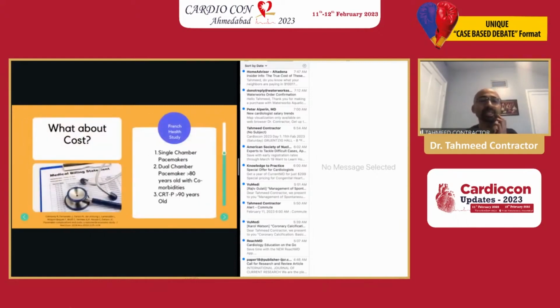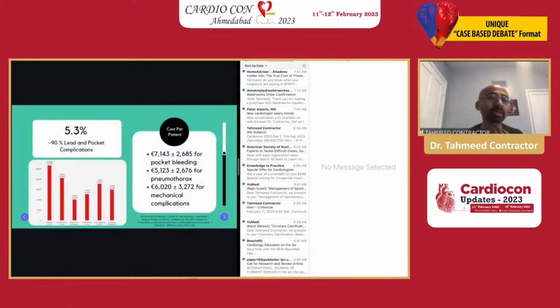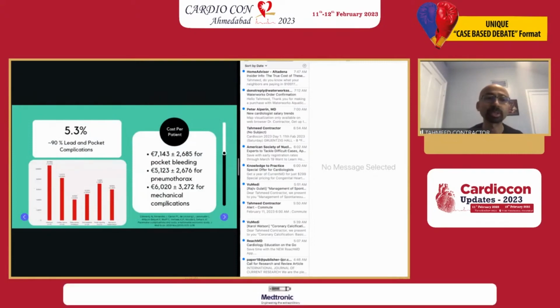Costs have also been a concern, and this was a French health study that looked at patients in 2015 that could have been candidates for a leadless pacemaker. Those undergoing single chamber pacemaker, or more than 80 years old with dual chamber, or those with CRTP implants greater than 90 years old. We looked at the cost of these complications that happened in these patients. 5.3% risk of complications, mostly lead and pocket complications.